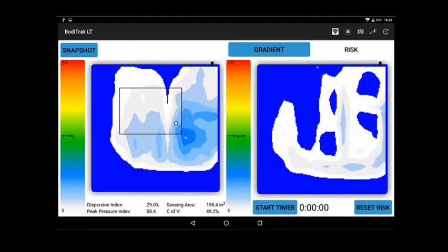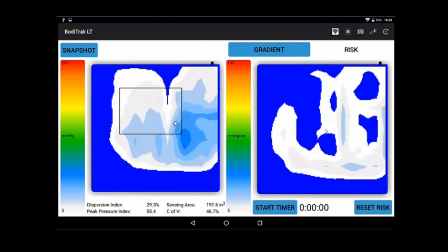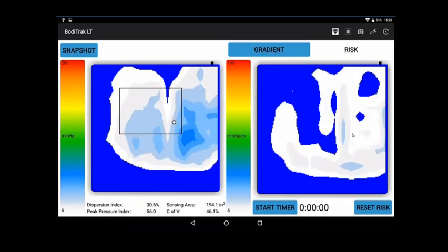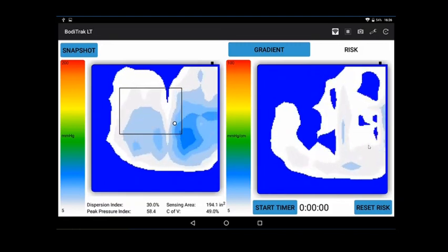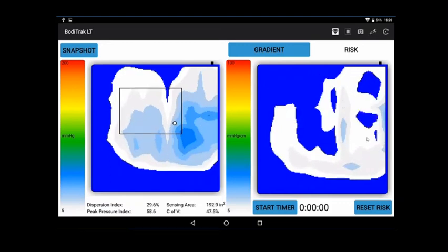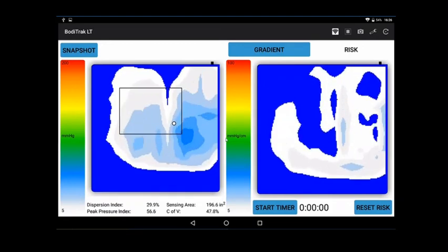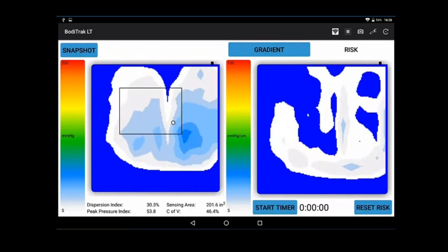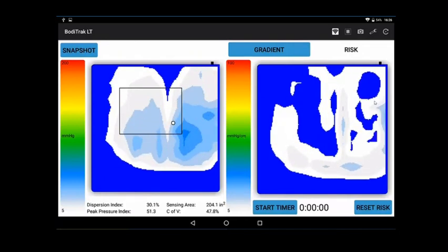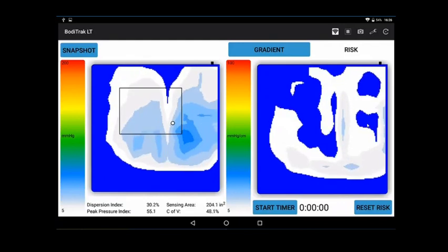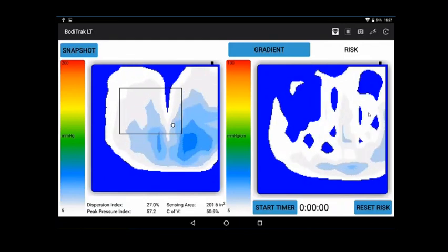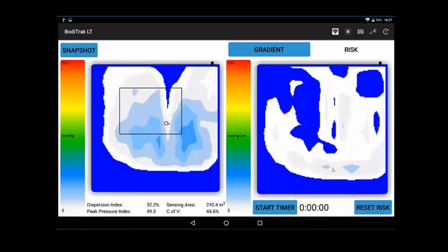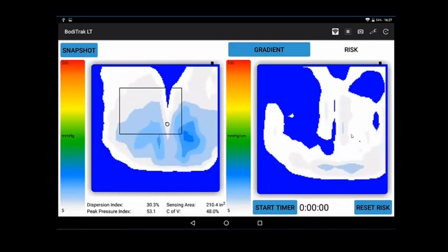You'll see there's nothing in the middle compared to higher pressure here. So we're mapping the curve, or the slope rather, of the mountain so to speak. The faster the pressure moves from one location to another, measured in millimeters of mercury per centimeter, you'll get hotter colors. That's an indication of where shear might be happening. The tissue is under stress because the pressure is moving so fast, and that's an indication of possible shear happening in those locations.